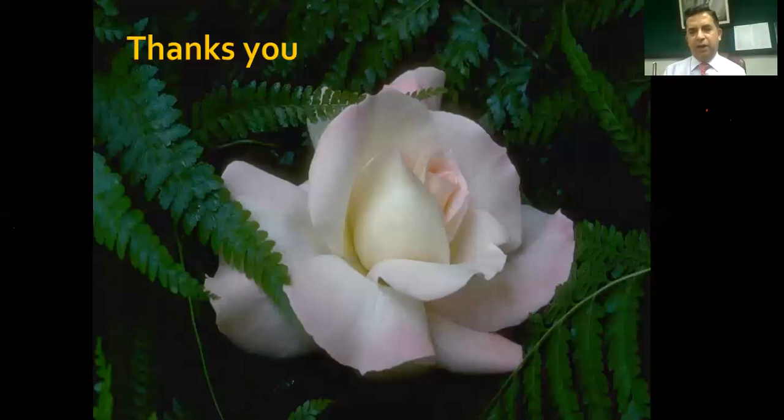So let me summarize the whole neck imaging using the nuclear medicine technique. We do a thyroid scan for the imaging of the thyroid gland itself. Then, related to thyroid cancer, we primarily use radioactive iodine. Then I talked briefly about the parathyroid adenoma, where we localize it with the technetium sestamibi two-phase scan.